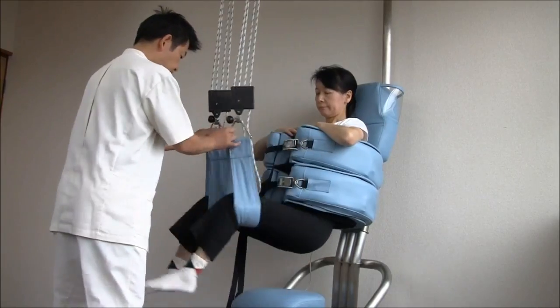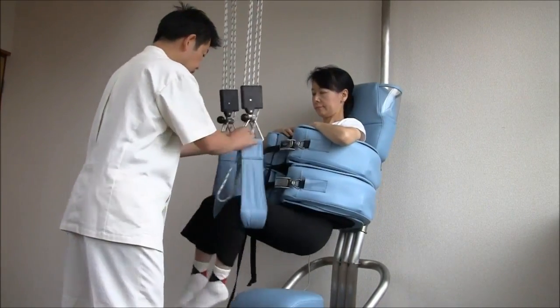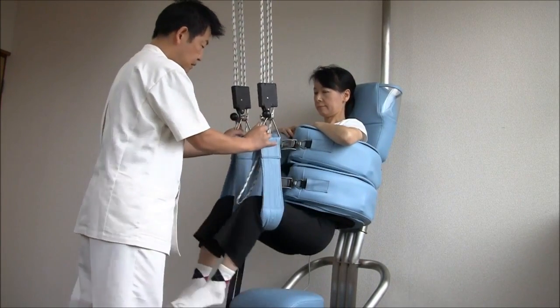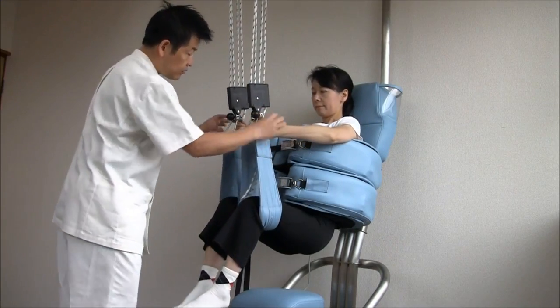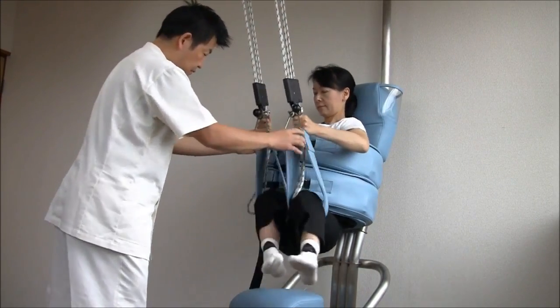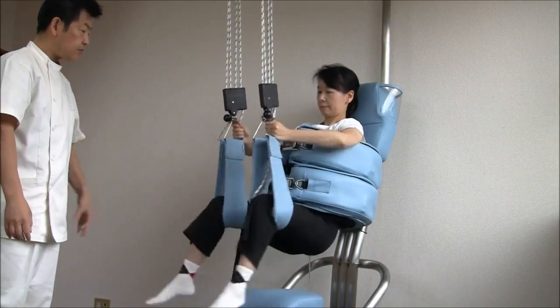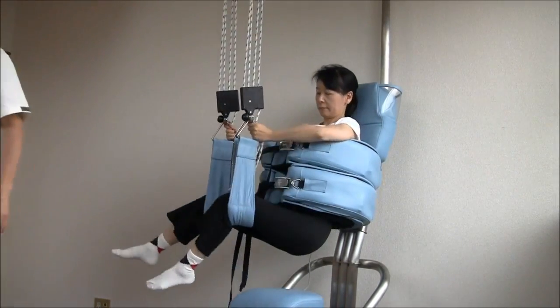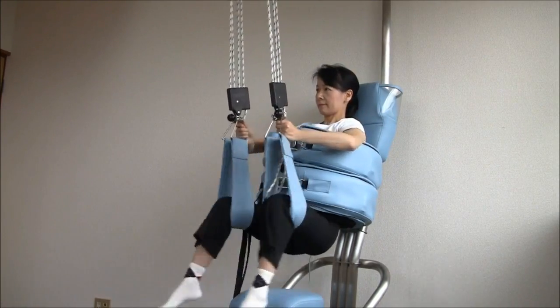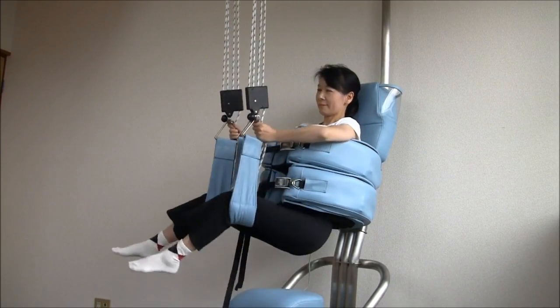Chapter 4. Self-exercise. The PT or DC should check how relaxed the patient is. When you can confirm that the patient is relaxed, have them do the swinging themselves. However, if there is any pain associated with the exercise, they must stop the swinging. If the patient is not experiencing pain, continue to do the same exercise.